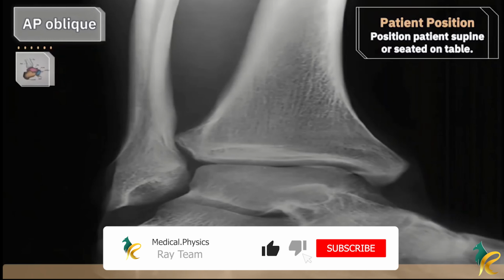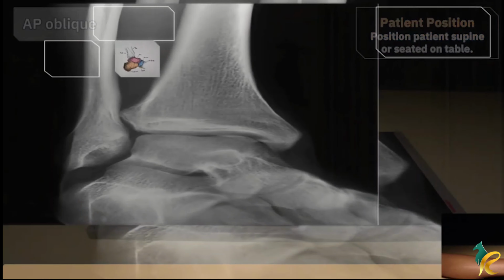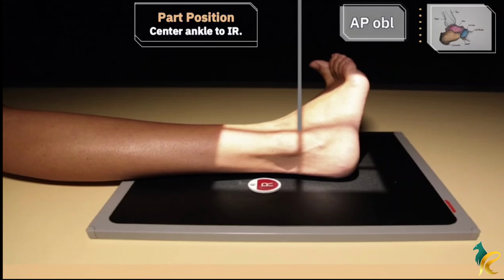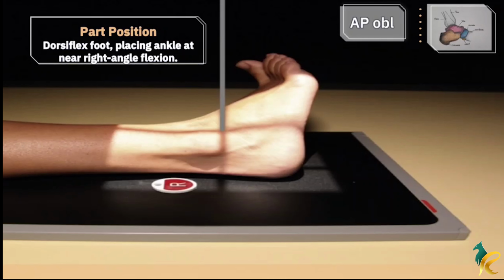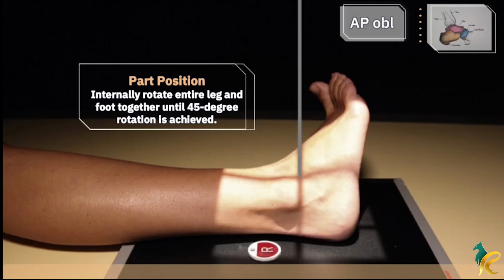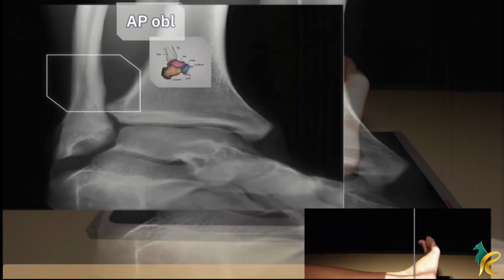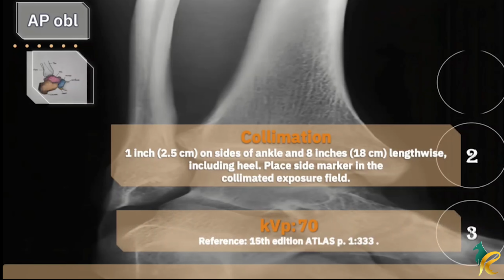For the oblique imaging of the ankle, we have to position the patient supine or seated on the table for the oblique position. We center the ankle to the IR like any other ankle imaging, and flex the foot, placing the ankle at near right angle flexion. To match the oblique position for this imaging, we have to internally rotate the leg and foot together until the 45-degree rotation is achieved. Our central ray is perpendicular to the ankle joint, entering midway between the malleoli.